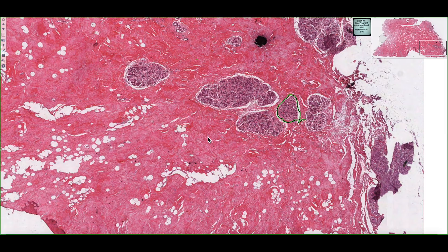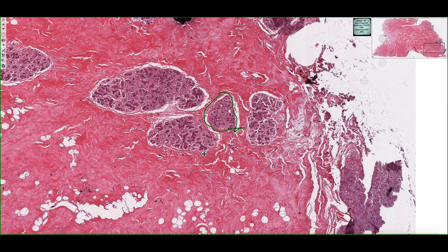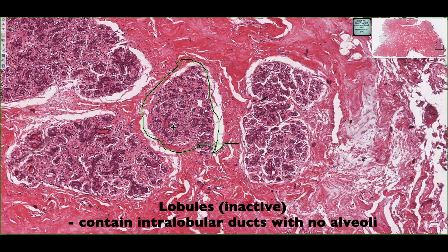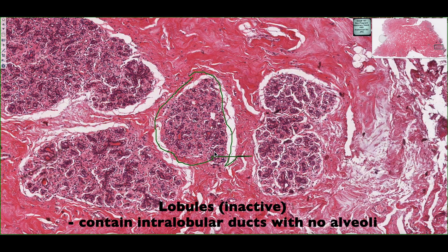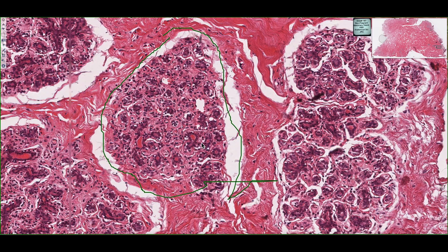We can also see these clusters of cells. These clusters are important because they are called lobules. Within each one of these lobules, we're actually going to find a series of ducts. In an active mammary gland, we'd see ducts as well as glandular tissue or acini. But since this is an inactive mammary gland, we actually only see just the ducts.